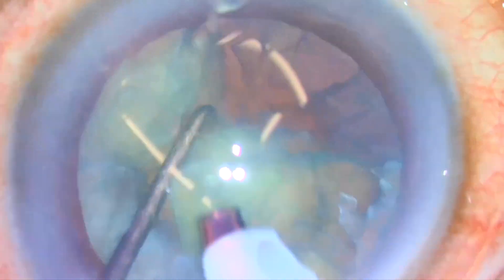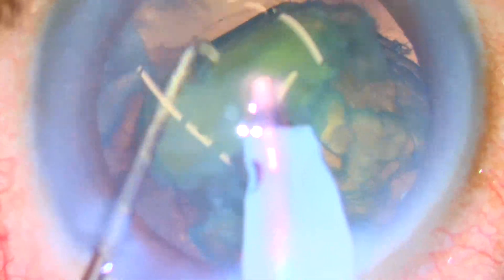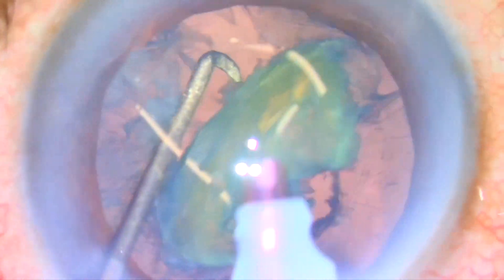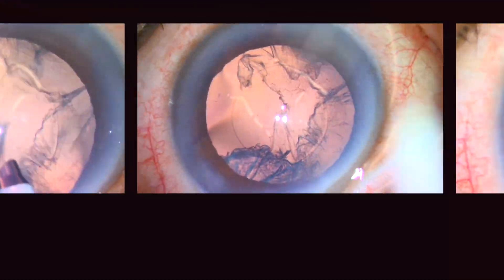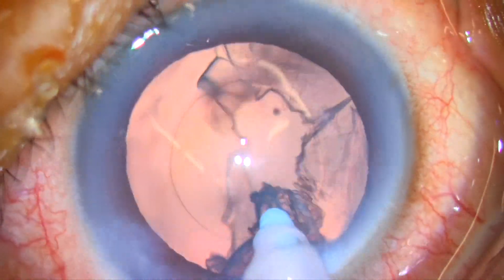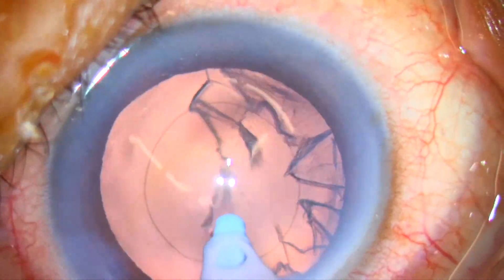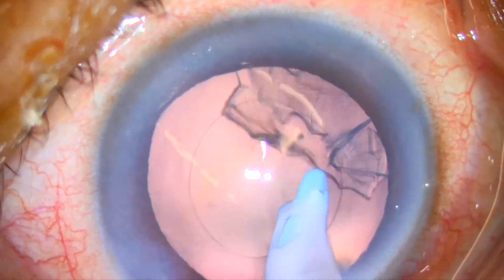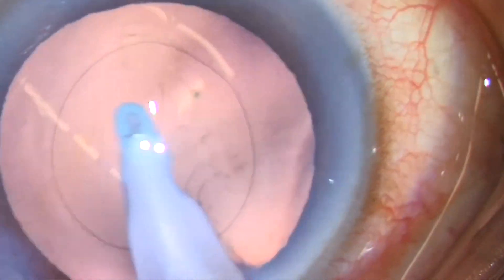Here's a routine cataract surgery case. We have safely created a 5mm anterior capsulorexis with a cystotome attached to viscoelastic. We safely remove the nucleus with our usual chopping technique, and now we remove the cortex from within the bag.